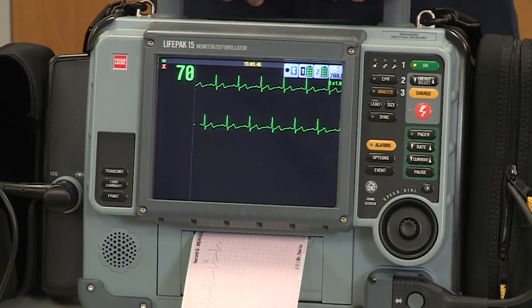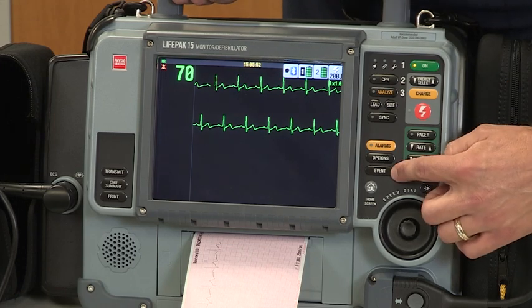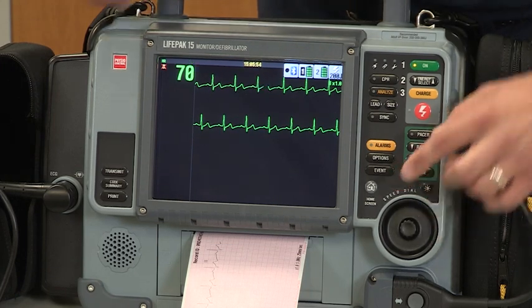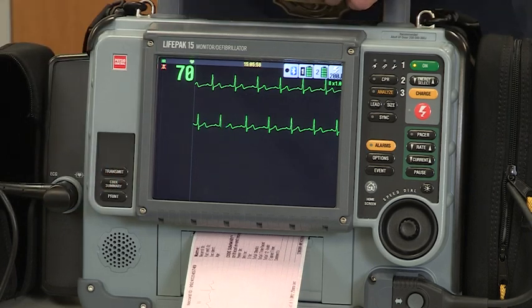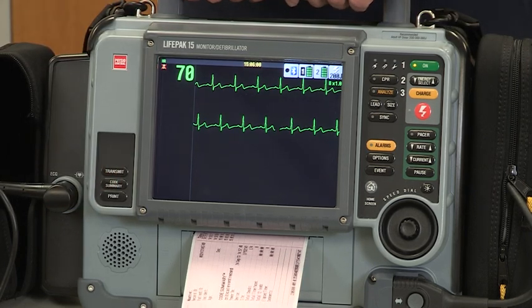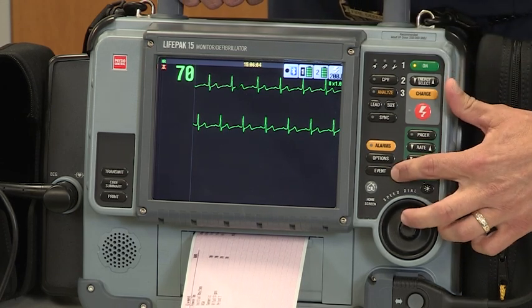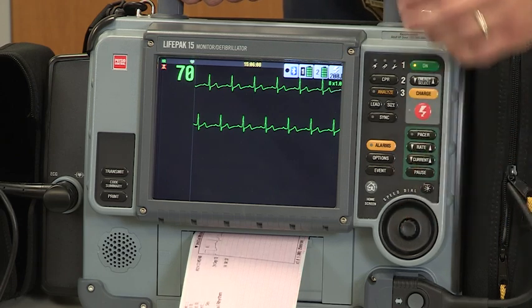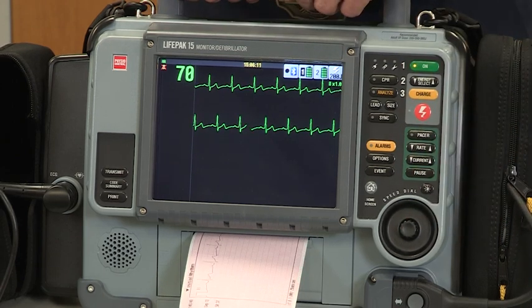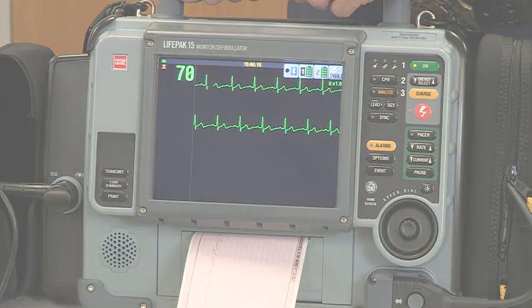At the end of the call, or if you'd like to recall what time you administered aspirin to a patient, if you used the event button that I showed you earlier, simply go to the code summary and depress it once. It'll print out the information that you put in, such as if you gave glucose, what time you gave it, aspirin, and such. It'll also print out a rhythm strip.